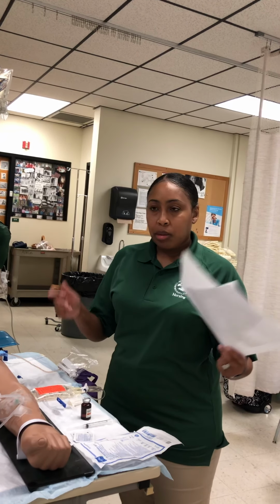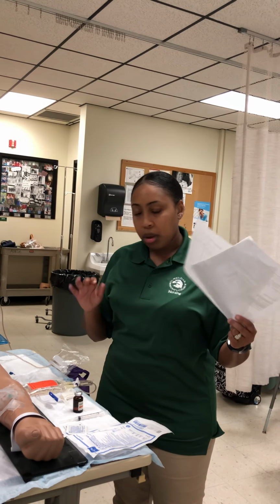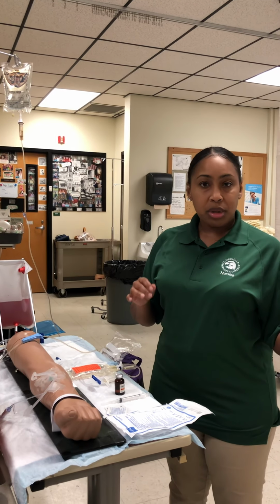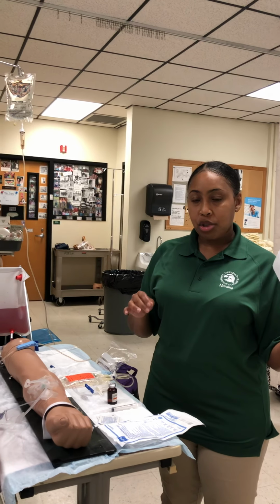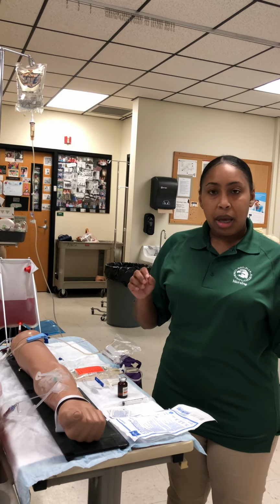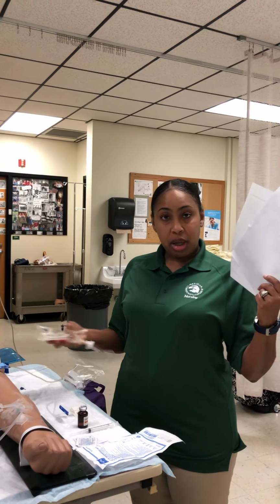And we already checked compatibility. We looked at our pertinent lab information. So now we're going to make sure that the medication is a safe dose. And we do know it's a safe dose because we already calculated our dosage prior to administering our medication. Our furosemide does not have to be diluted. We can give it undiluted. And we can mix our gentamicin with 50 to 200 milliliters of any compatible diluent. We're going to give furosemide at a rate of 40 milligrams or a fraction thereof over 1 to 2 minutes. And I already said the rate we're going to give the gentamicin is over 60 minutes.